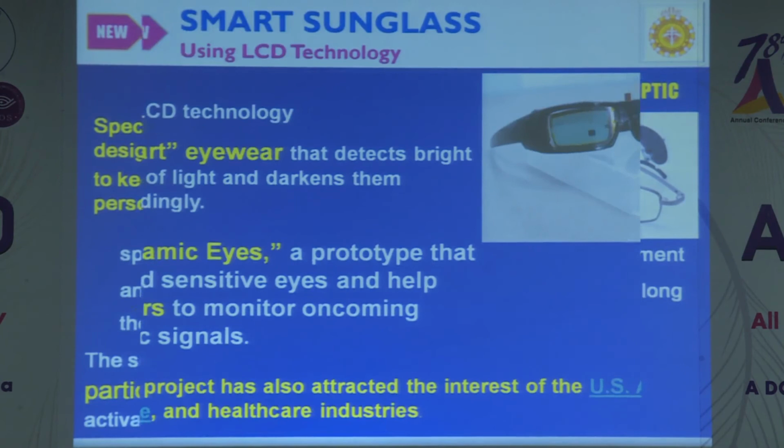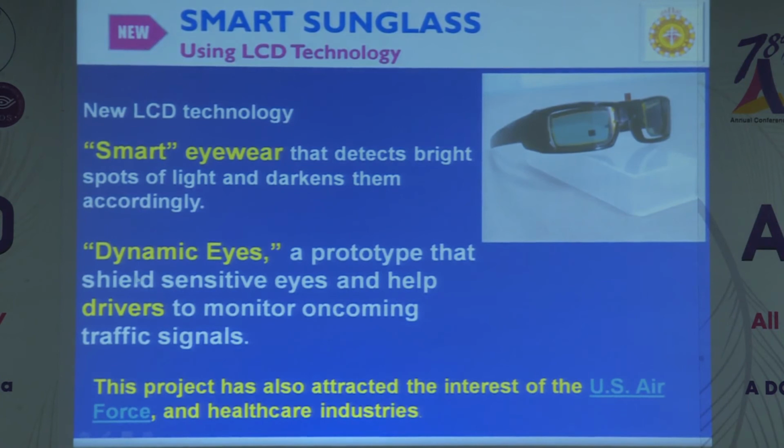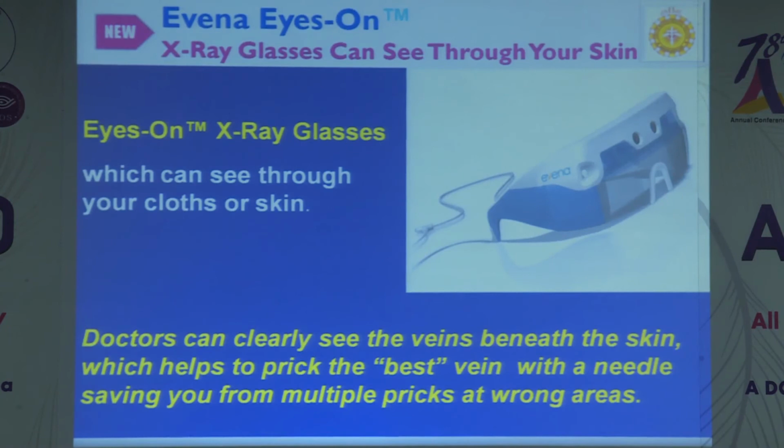Sunglasses are also available with dynamic eyes. That's for night driving. A special spectacle is available to detect a vehicle coming from far away. The Air Force also uses that spectacle. There's even a spectacle you can see through the skin with. So X-ray glasses are also available. That is ideal for taking an IV line and everything.